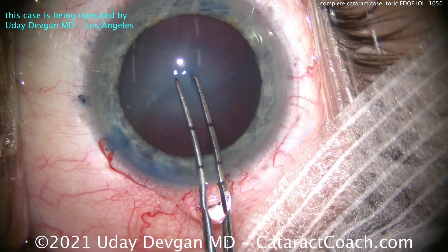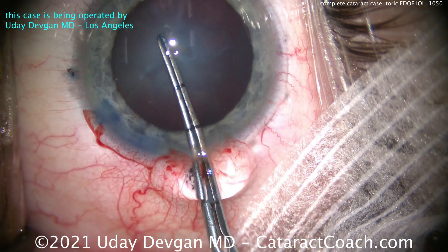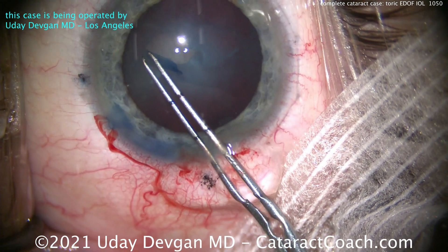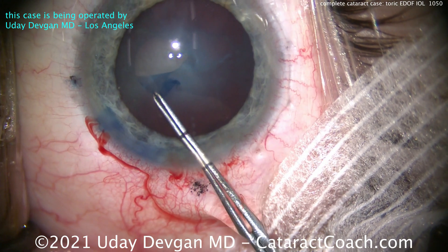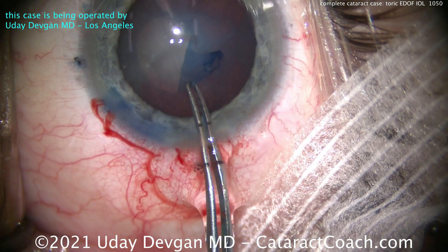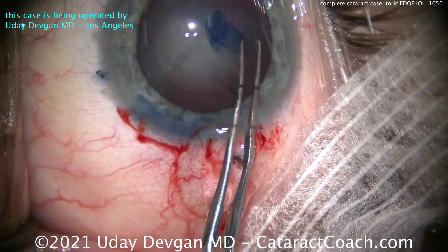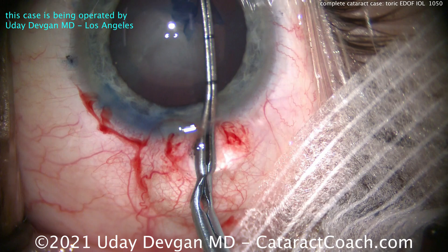Starting the capsulorrhexis — we want that 5-millimeter round capsulorrhexis well centered. We're measuring it carefully. Look at those forceps: you can see the marks at the tip which indicate two and a half and then five millimeters, so we're careful to create a really nice round centered capsulorrhexis.